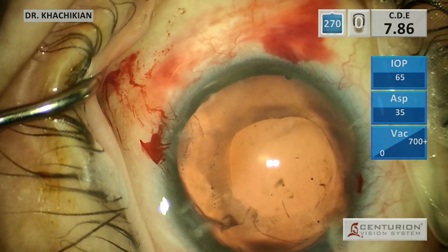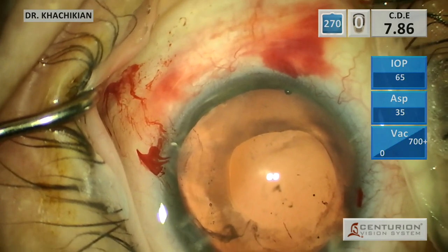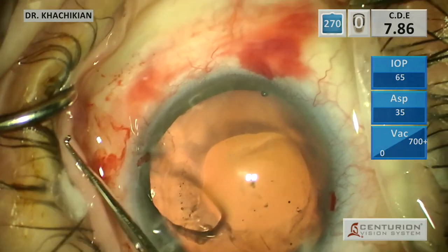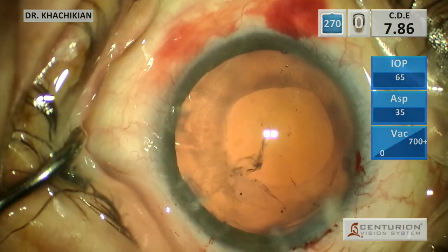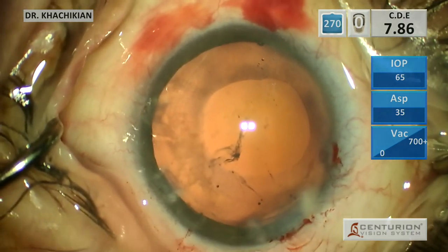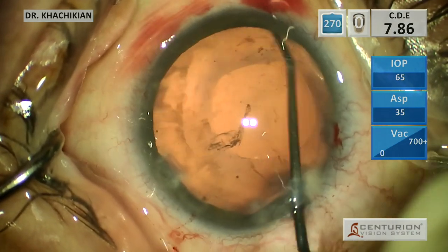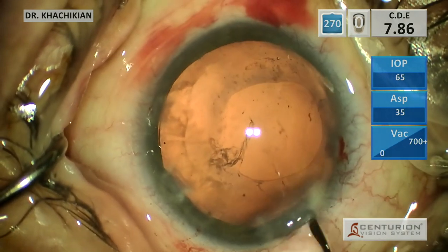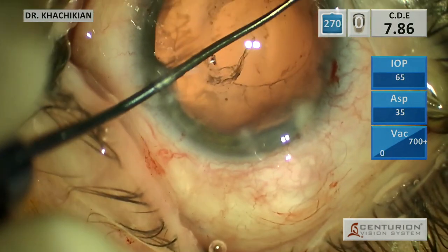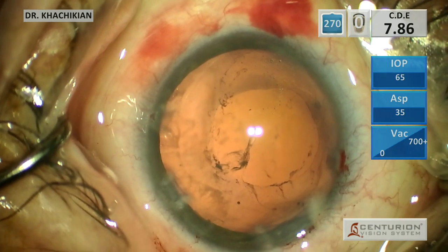The capsular tension ring by itself did a really good job at centering that bag, but I honestly don't think it's going to be enough. You don't want to come back the next day after a case like this finding out that the lens is not centered. So what we're going to do is put in one capsular tension segment - these are just great, excellent devices. We'll be gentle here and do some anterior capsule cleaning. Really, I just want to prevent capsular contraction that's going to dislocate this bag any further. So just really gentle cleaning, and now we're going to bust out our capsular tension segment.